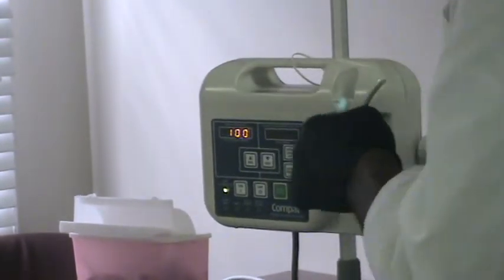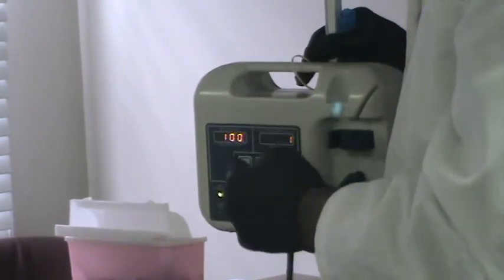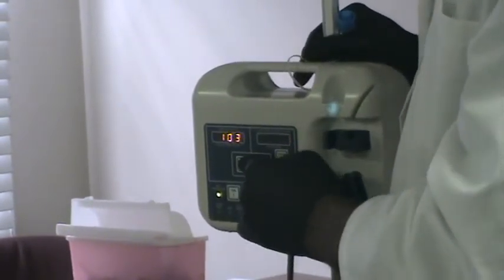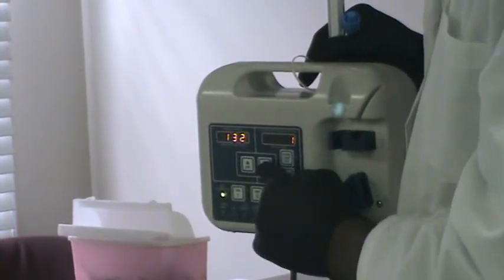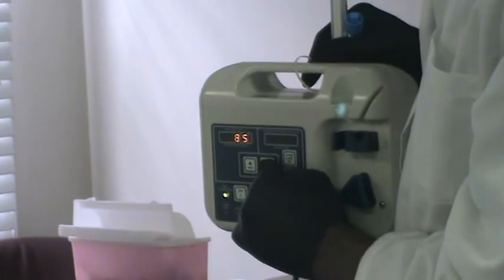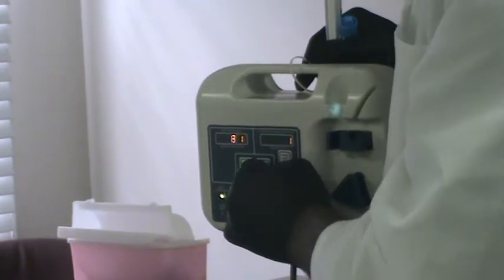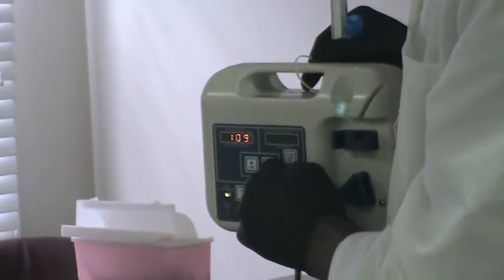According to the doctor's order, she's supposed to get 100 ml per hour. When you turn it on, you can set that. You can increase it, you can decrease it. Let's say it's 80 ml per hour, this should be 80. But she's 100, so increase it to 100.